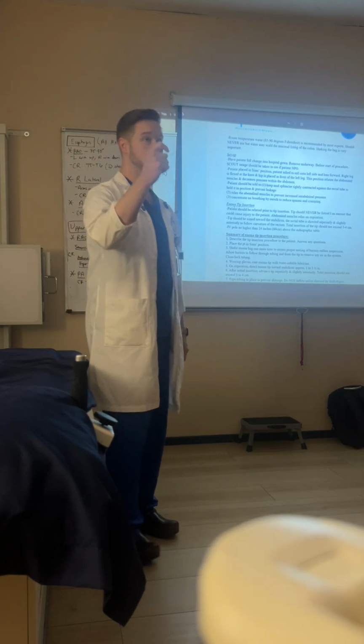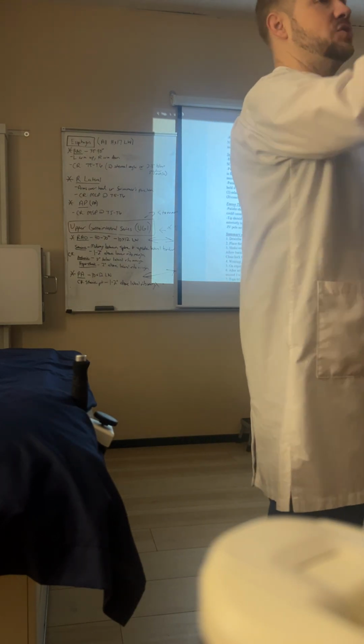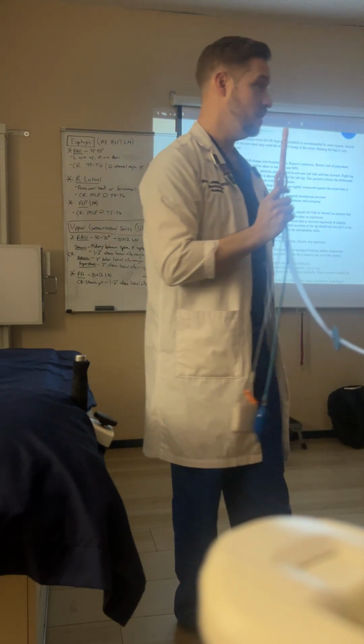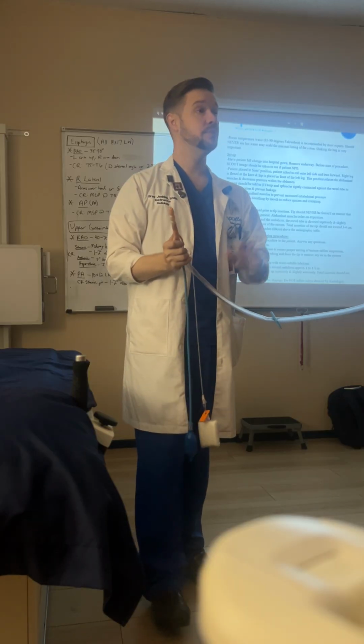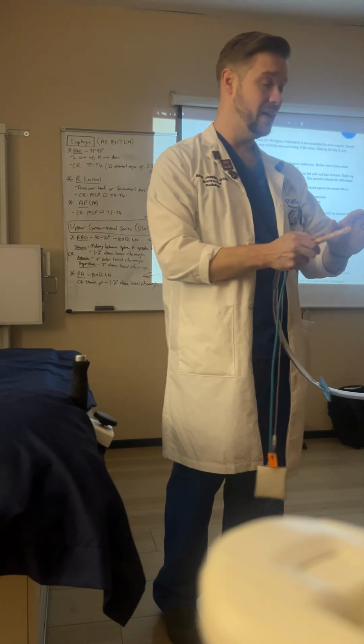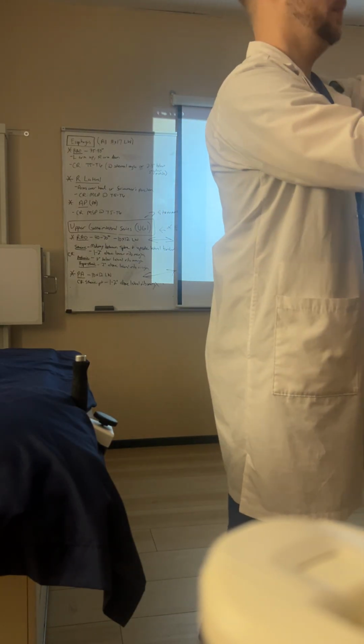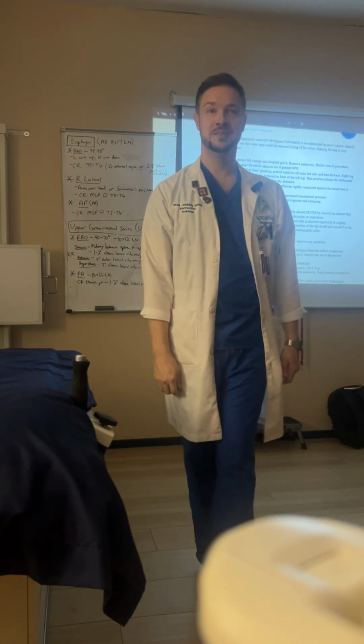So before you insert this, when you've got them in the Sims position, you've got your lubricant on the end here, you're going to say, okay, I'm about to insert the tip. Take a deep breath, blow that breath all the way out. As they're exhaling, you're going to insert the tip, okay? For patient comfort. So like a thermometer with the baby? Kind of, sort of. In some sense.